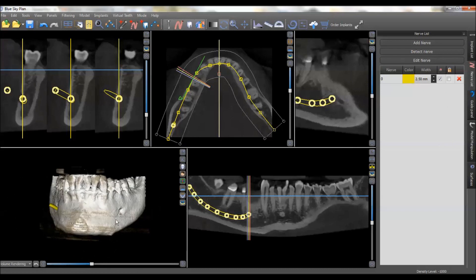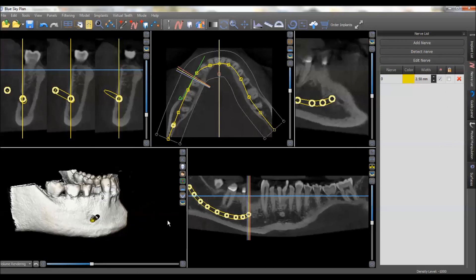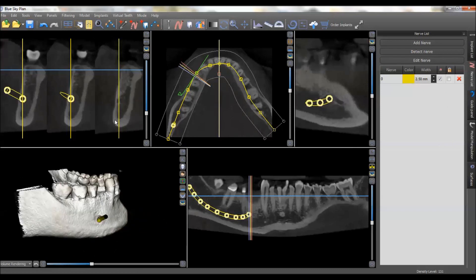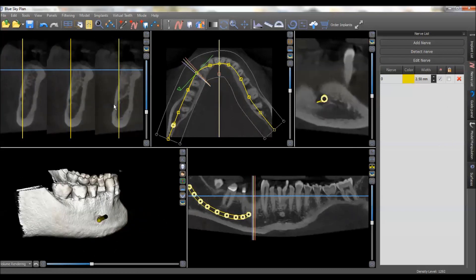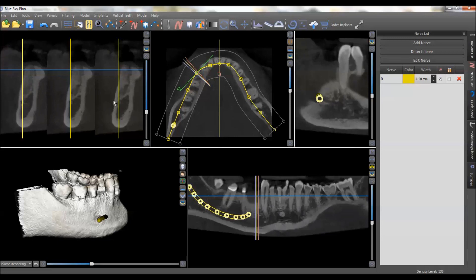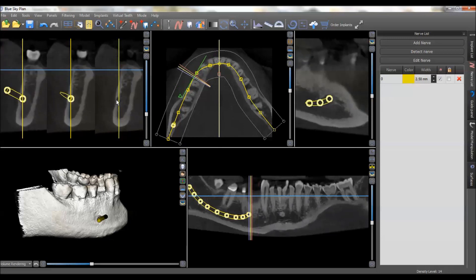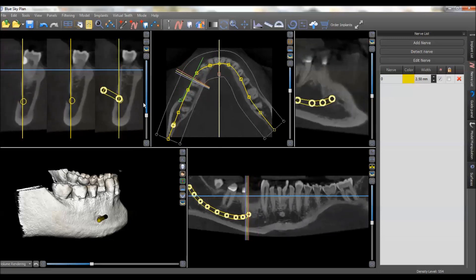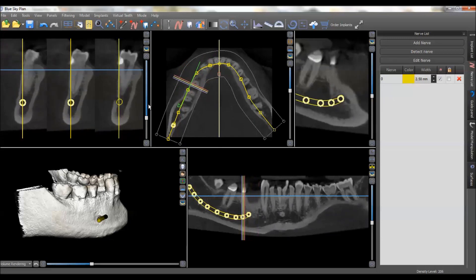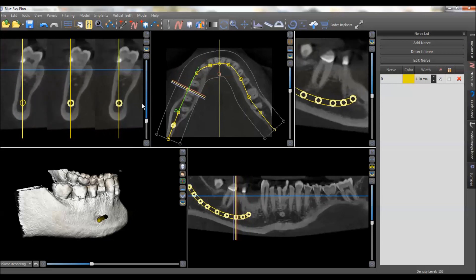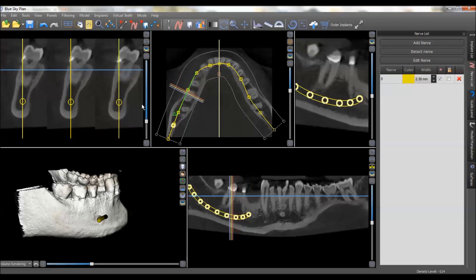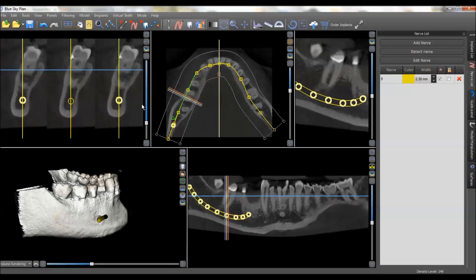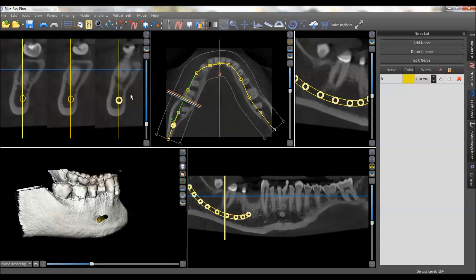As you can see, we're exiting nicely out of the mental foramen. We can scroll back and forth and confirm that we are in the nerve canal, so that looks very accurate. If needed, these little white dots that come up allow you to adjust the positioning, but I'm very happy with the nerve position.